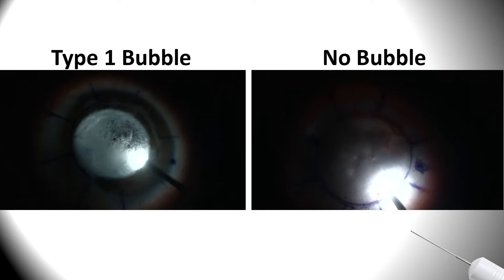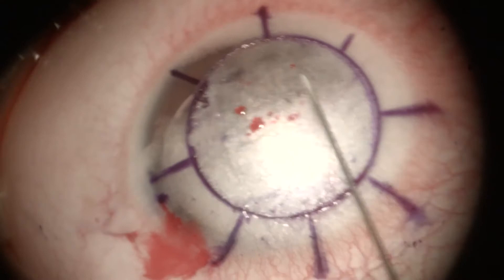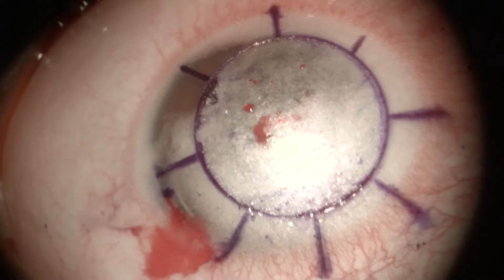This other post-corneal infection case starts with a complication: the air breaks into the anterior chamber. So what to do next — continue with DALK or convert to PK? To make this decision we decided to assess the bubble. In our first try we can see the bubble, but we're not sure of its size, location or type. The next step is to proceed with another delamination. Now it is more clear the presence of the bubble. To be sure, we proceed with still another keratectomy. Now it is clear that we are in the presence of a type 2 big bubble, characterized by being decentered and having a slimmer border than the type 1. We continue transilluminating to confirm that the image belongs to the bubble and not to the air in the anterior chamber.